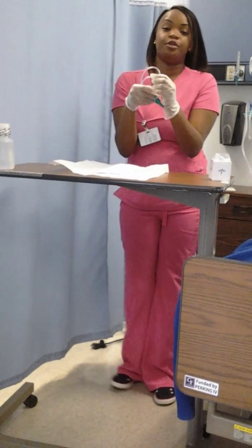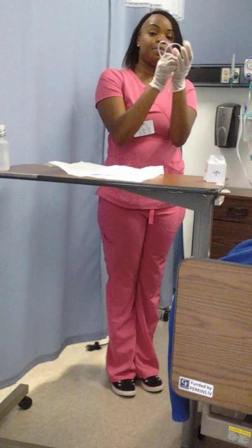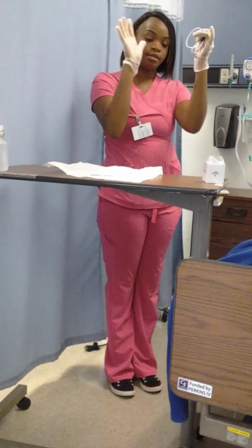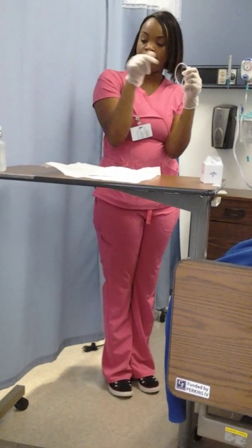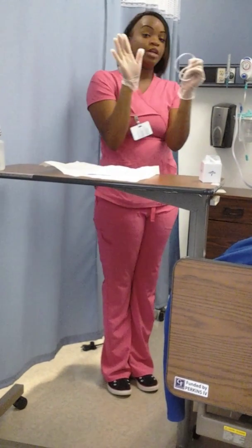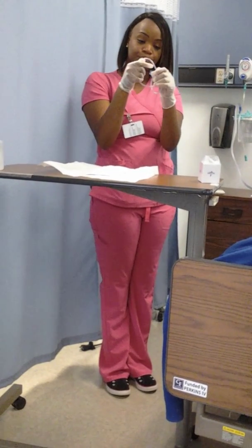Now, while I have two sterile hands, I'm just going to stop and do a reality check. Intermittent suction is on. Sterile gloves on. Saline is in my cup. Patient is up. We got the distress signal. Orders are verified. We can go ahead and get started.